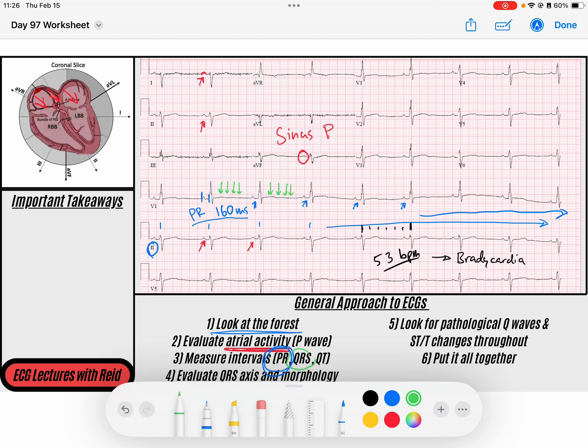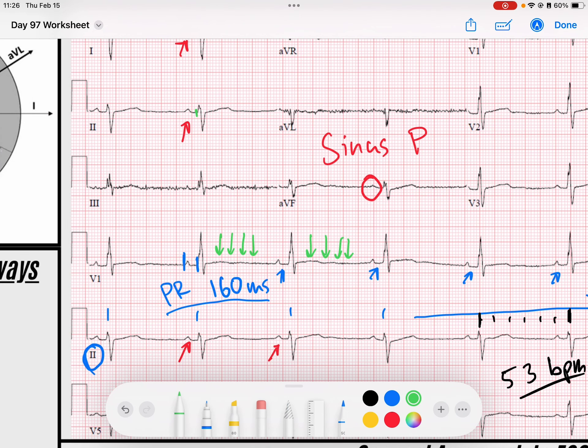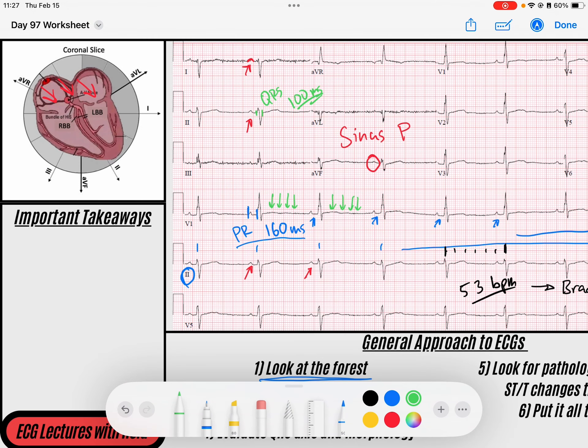Next thing I'm going to do is evaluate my QRS complex. We said it was right on the border of narrow. If I measured the width here, it looks to be about two and a half small boxes maybe. So my QRS duration seems to be maybe 100 milliseconds, which is normal. My QRS is negative in lead one and appears to be about isoelectric in AVF. So what does that mean? If it's isoelectric in AVF, that means my QRS axis is perpendicular to that. And the fact that it's negative in lead one tells me it's going away from lead one, so my axis is deviated to the right.